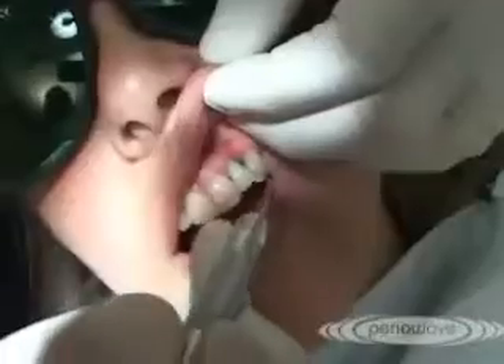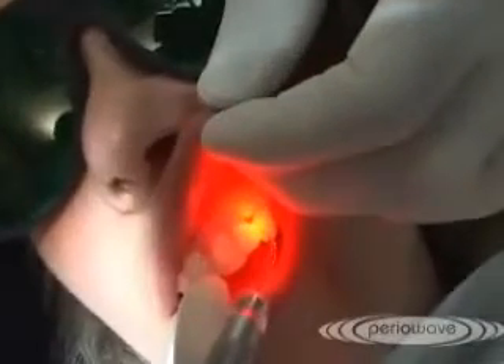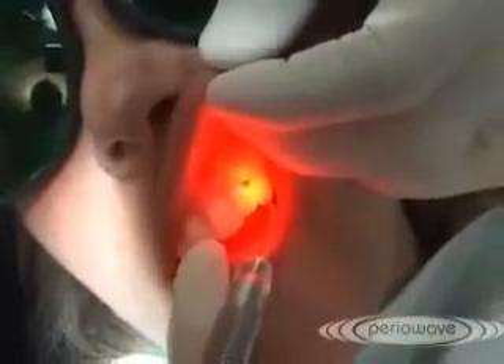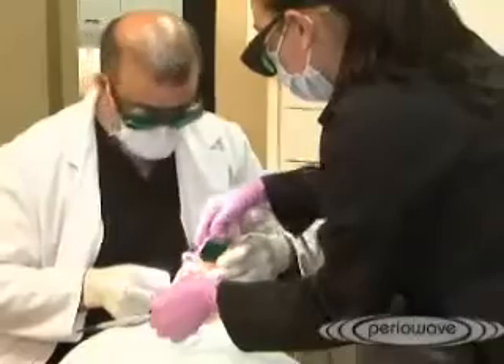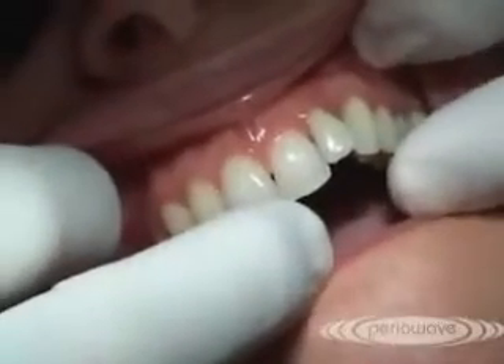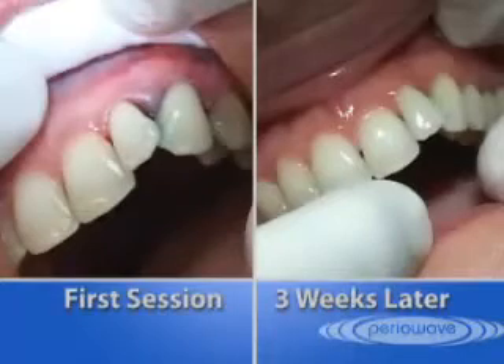We want to gently, in small increments, keeping in mind that the radius of kill is approximately two to three millimeters. We had scaled and root planed teeth 21, 22, and 23. If we take a look over here, you can definitely see the difference in the texture of the tissue.